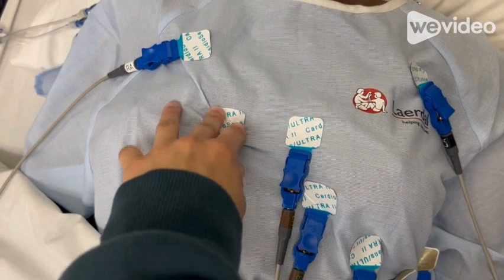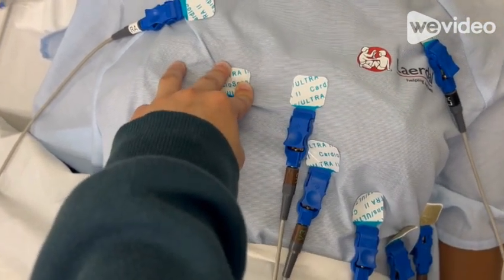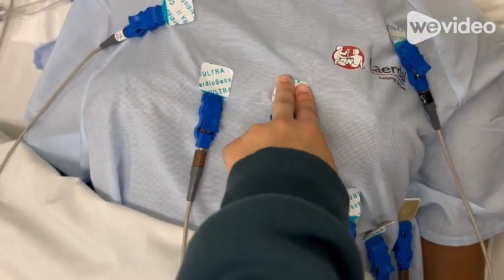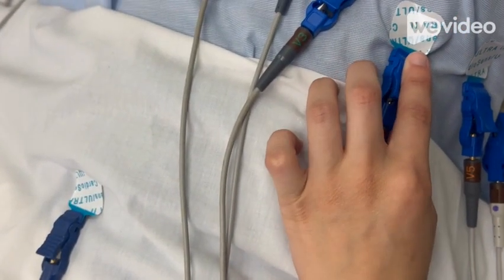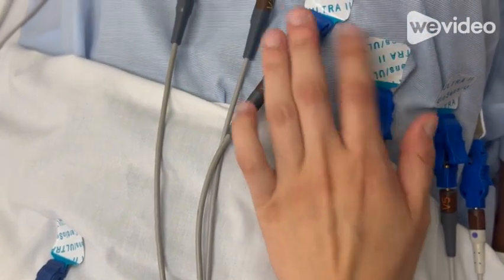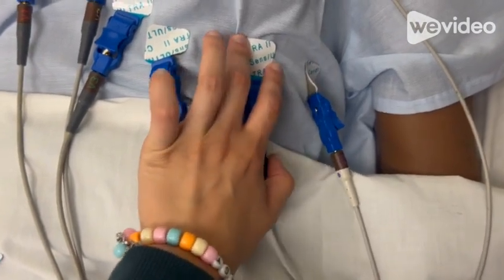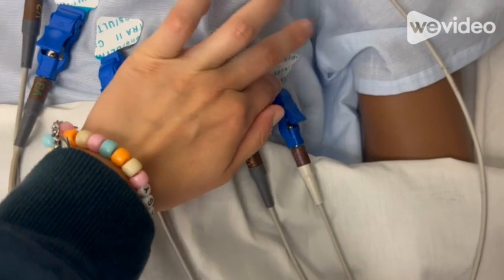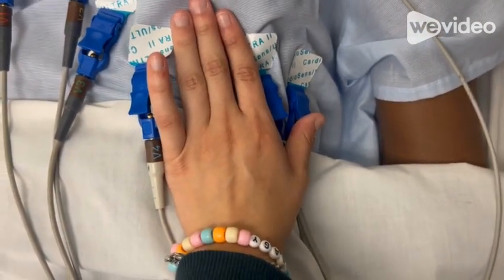V1 is the first electrode to be placed on the patient, and it is placed in the 4th intercostal space on the right side of the sternum. V2 is placed on the opposite side of the sternum in the 4th intercostal space as well. V4 is placed in the 5th intercostal space of the ribs, mid-clavicular line, then V3 is placed directly in between V2 and V4. V5 will be placed at the same level as V4 on the anterior axillary line, and V6 will be placed in the same level as well on the mid-axillary line.